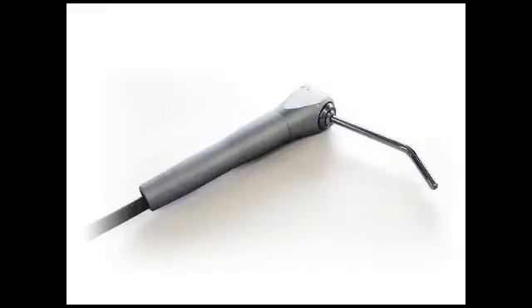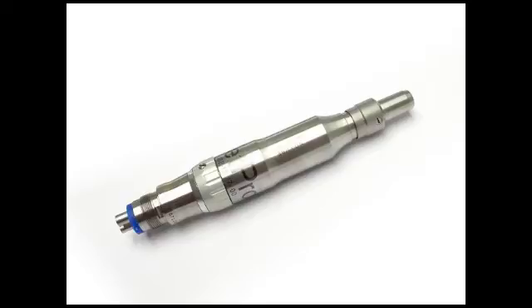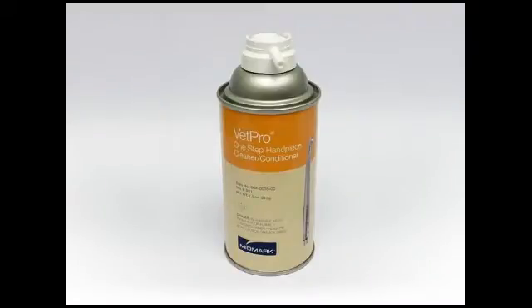Each unit comes with an air-water syringe located in the manila envelope, a high-speed handpiece, a burst starter kit, a low-speed handpiece, a 10-pack of disposable profi-angles, and a bottle of handpiece conditioner.